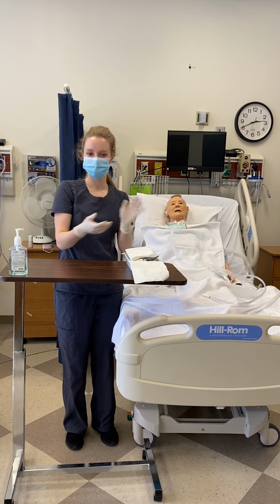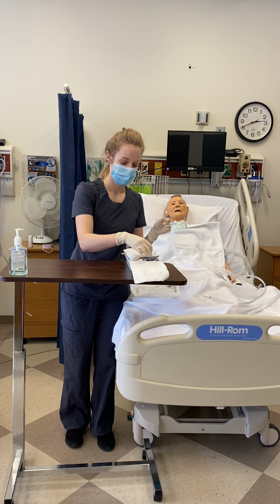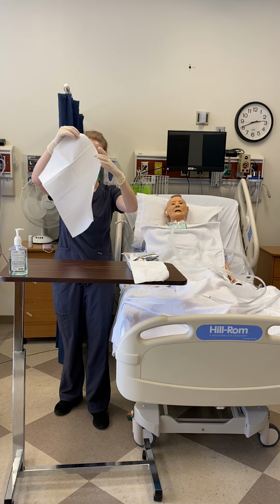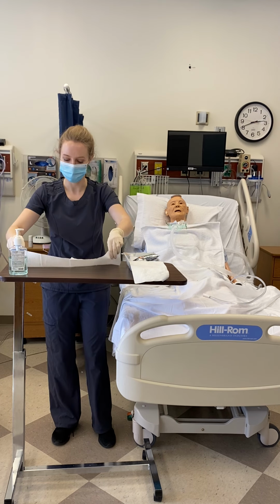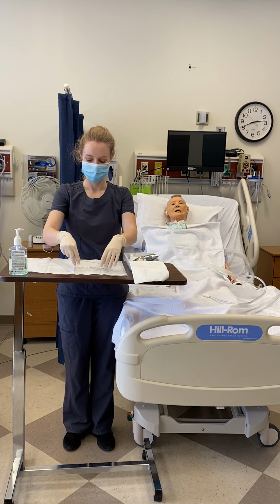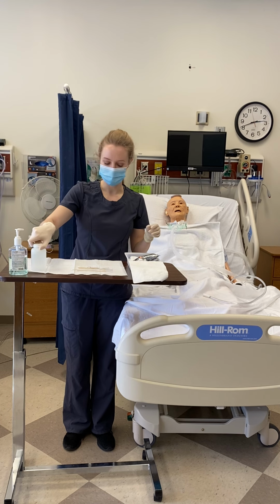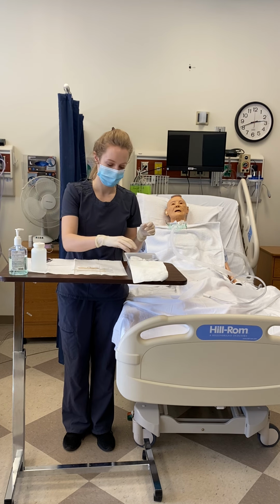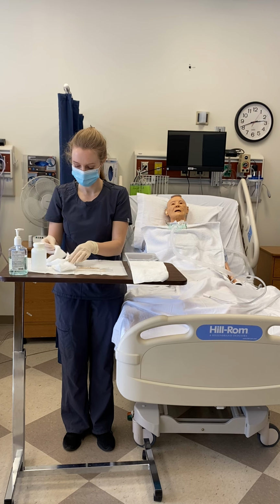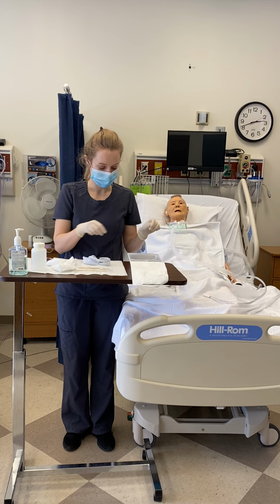So once I'm sterile and I have Mr. Smith ready to go, I take my little sterile field here, and I put that out, and I look at what I have in my sterile kit, and I have swabs, I have saline, I have hydrogen peroxide, I have a new bandage and some gauze here, and I have a new trach bandage.